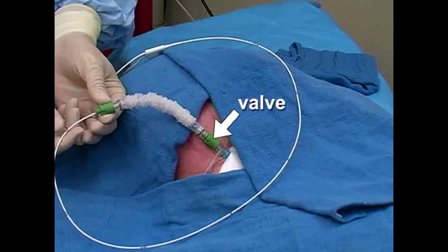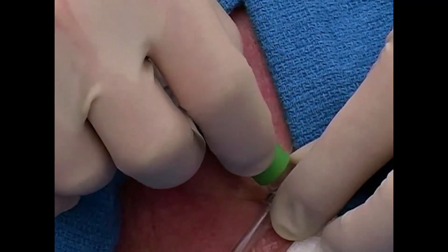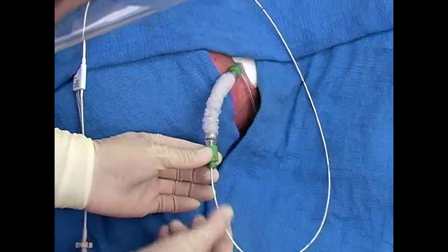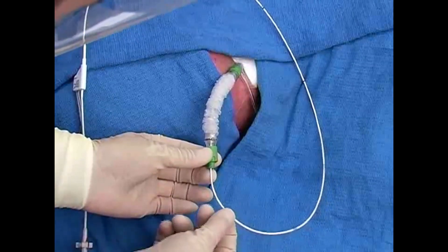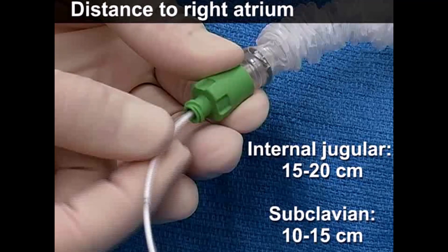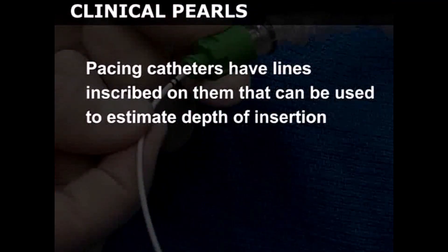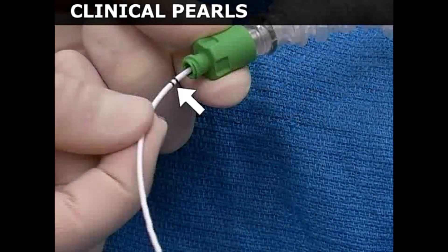Note that many sheath introducers have a closable valve, which must also be opened before advancing the catheter through the introducer and into the central circulation. Continue to advance the catheter until the tip nears the right atrium. For the internal jugular approach, this distance is approximately 15 to 20 centimeters; for the subclavian, 10 to 15 centimeters. Pacing catheters have lines inscribed on them to estimate depth of insertion; the two lines depicted here represent a distance of 20 centimeters to the tip.